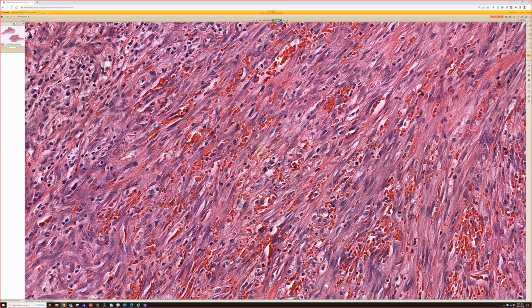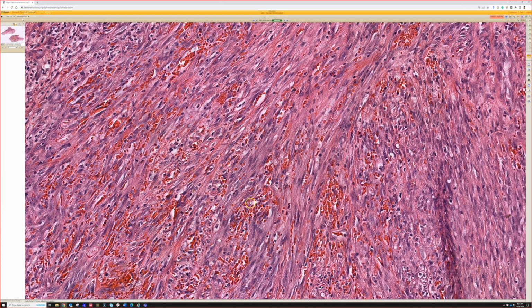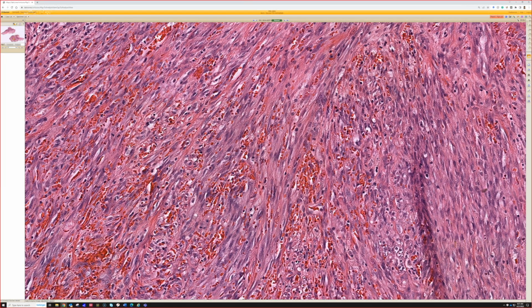Very good. And you know, Kaposi comes in a few different clinical appearances. There's a few different clinical scenarios and settings that Kaposi comes in, right? The classic type, which is in the lower extremities of older adults. People had traditionally said it's more common in Ashkenazi Jews or people of Mediterranean descent, but I have seen Kaposi in folks of all different ethnicities and backgrounds. Older adults get lower immunity, and the HHV8 virus, which is pretty common, can take over and cause Kaposi sarcoma on the lower extremities particularly.